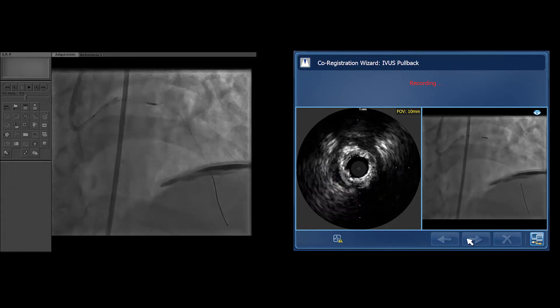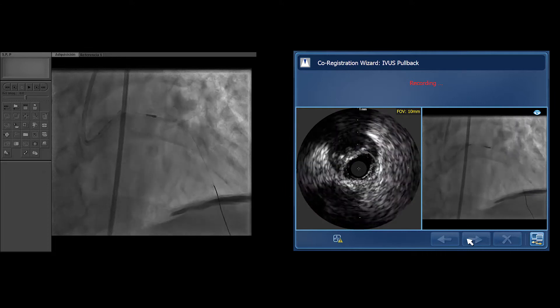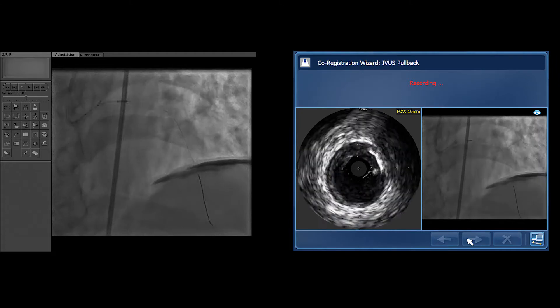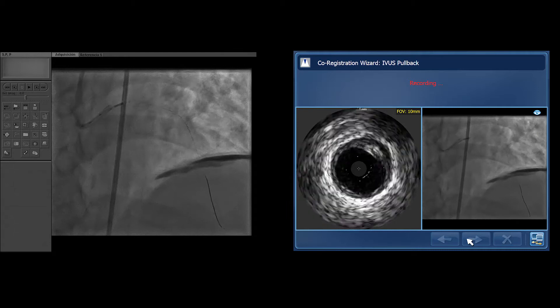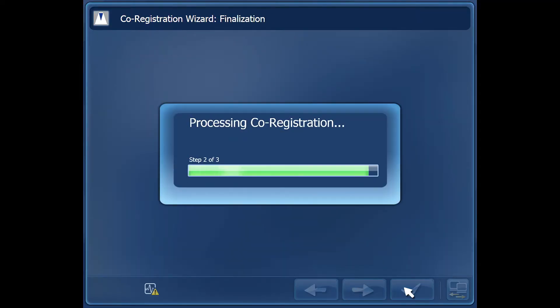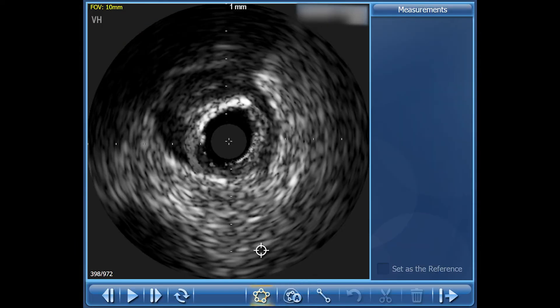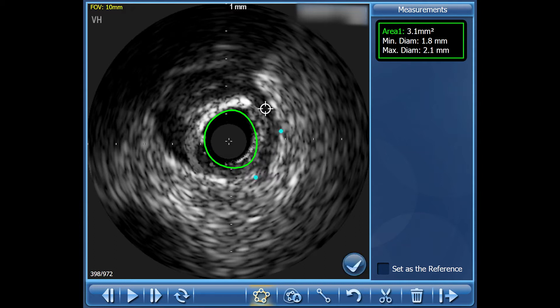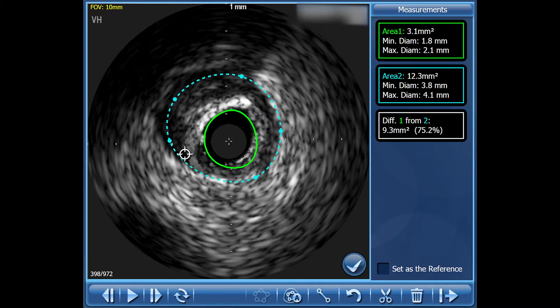In this particular case, the calcification visible as a ring of calcium precludes advancement of the probe to the distal part of the vessel, but we can still get valuable information from the proximal part. This will be used to determine the landing zones and, more importantly, the stent dimensions. You would have made a big misjudgment if you judged the size of the vessel just from the lumen — the vessel structure is about 4 millimeters, while the lumen is barely 2 millimeters in diameter.